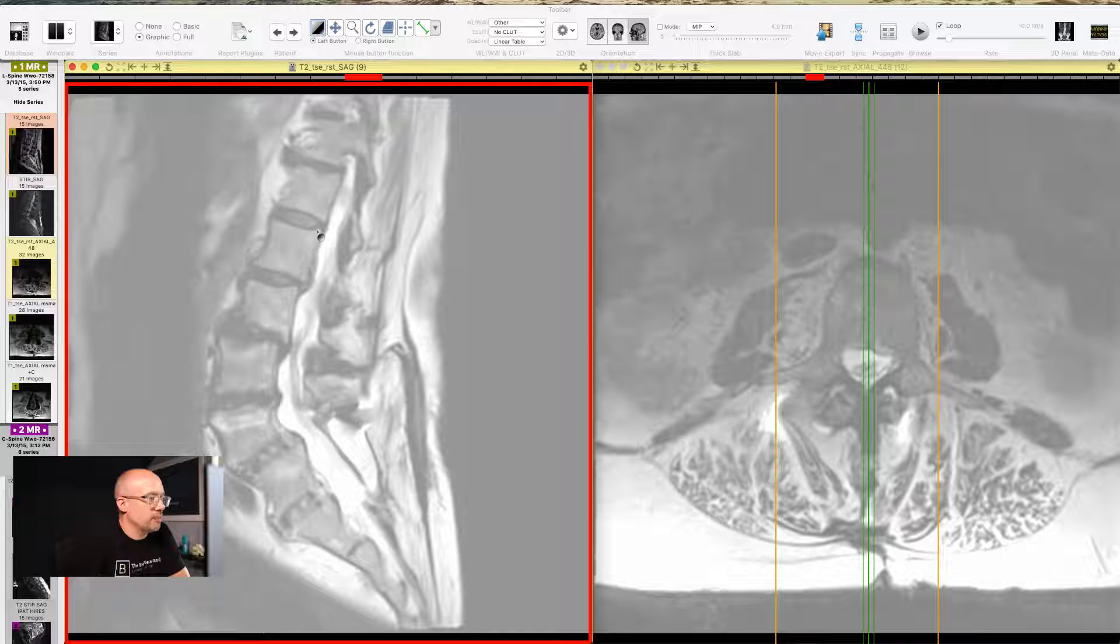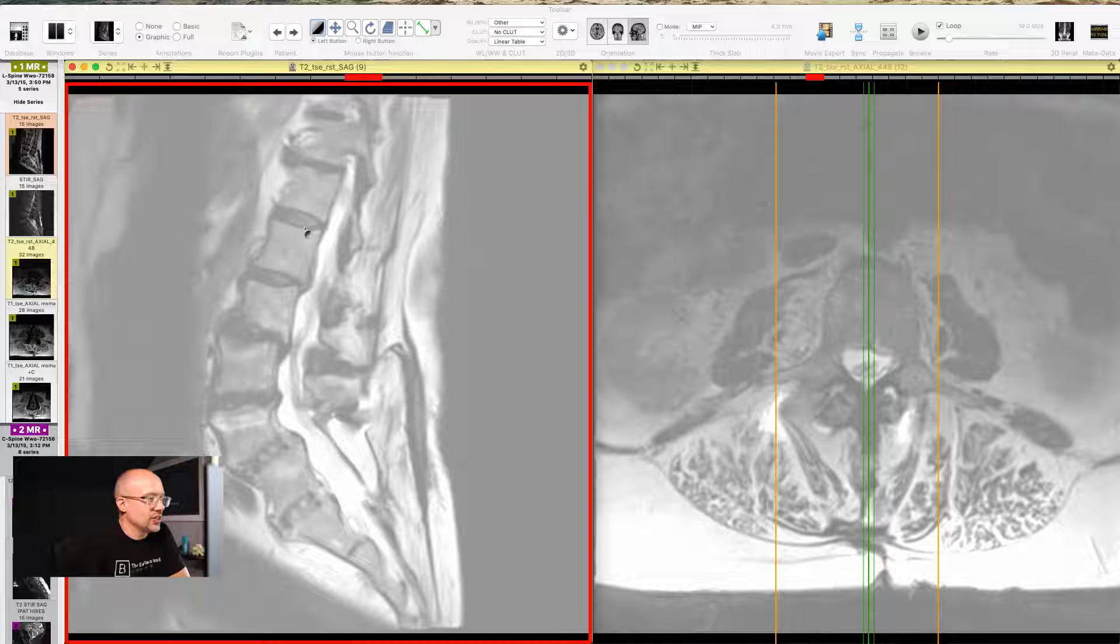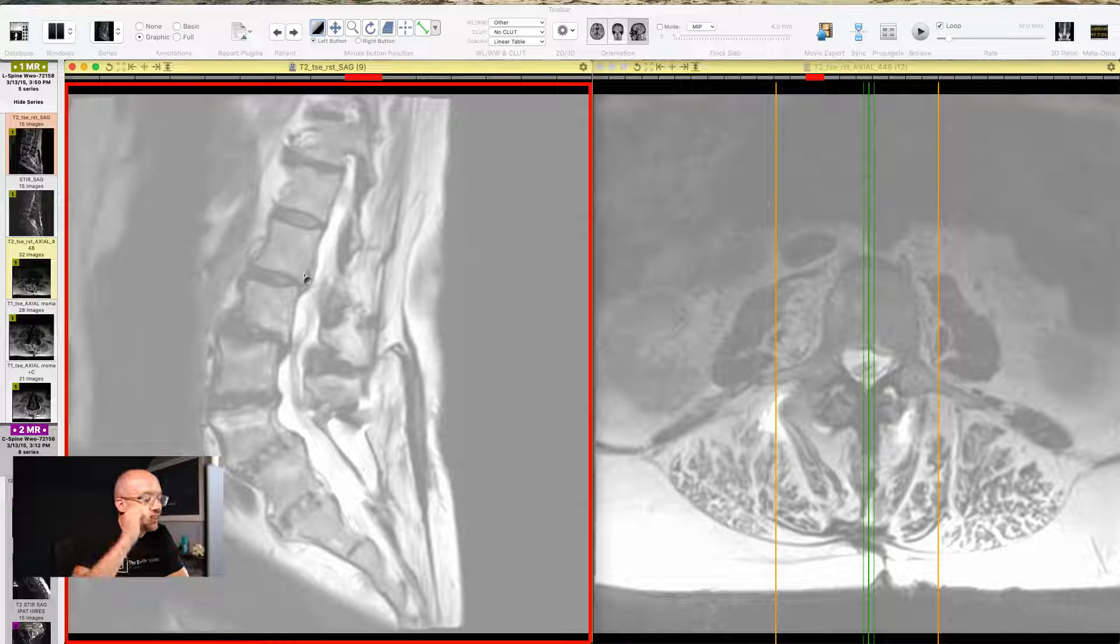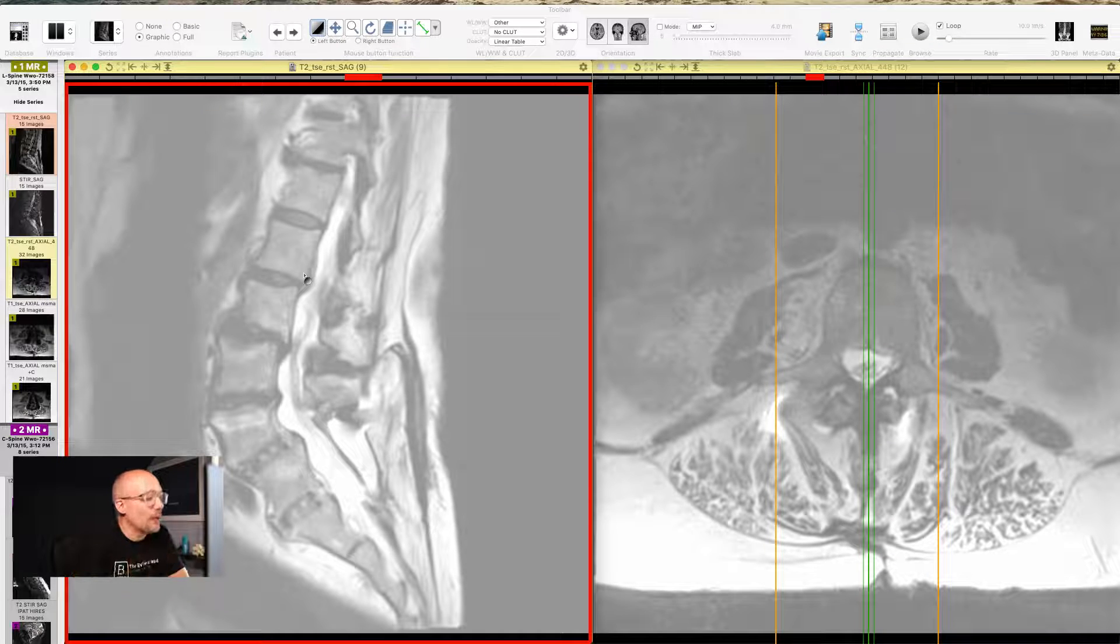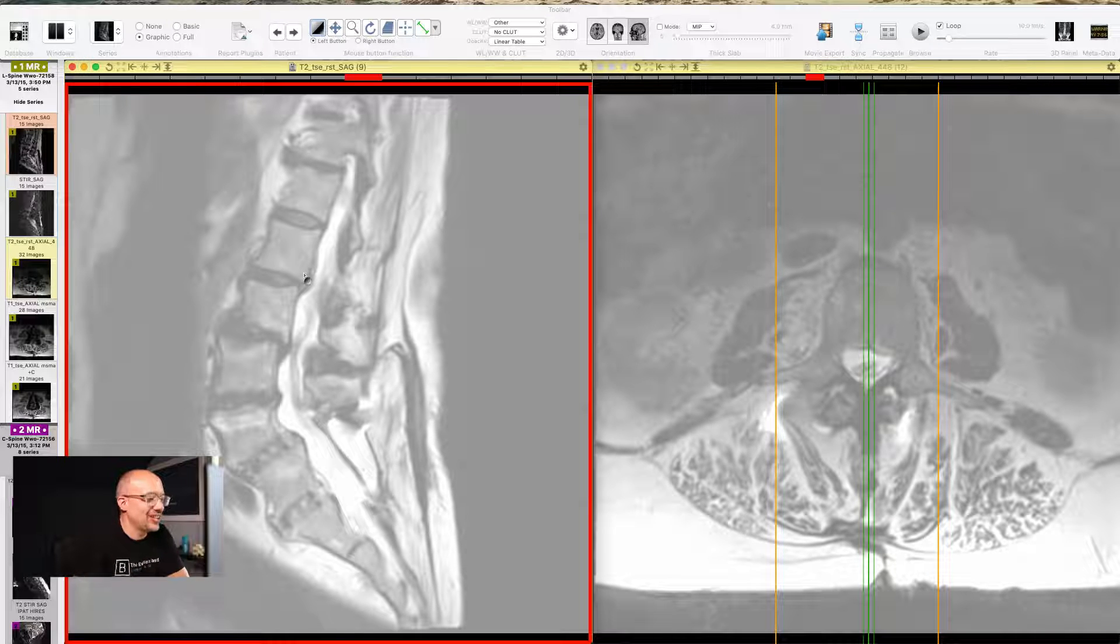So this bone is square. The vertebra is square. It's nice and gray. It's clear around all of the edges. That is normal. That is a good looking vertebra.